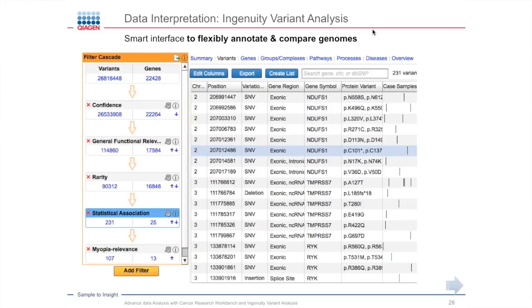So how does the tool look when you are actually looking into an analysis? Before going into my live demo, let's look at how it looks. Here is an analysis that I took a screen capture of. This is a cohort in this case. This is a really large cohort.